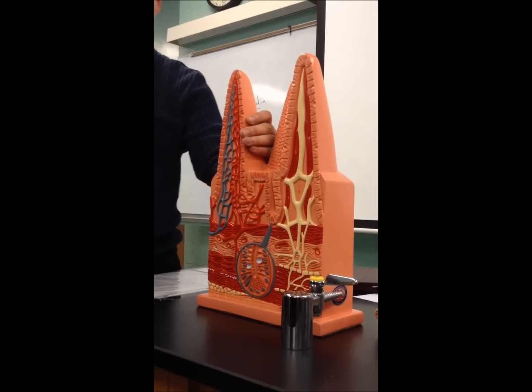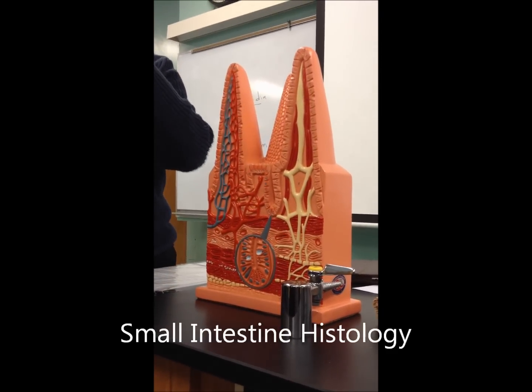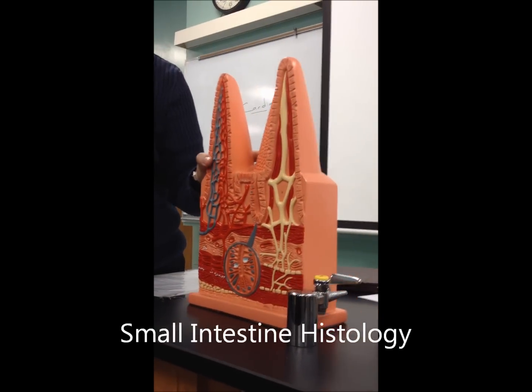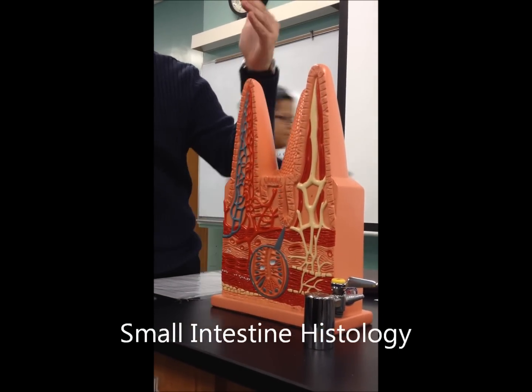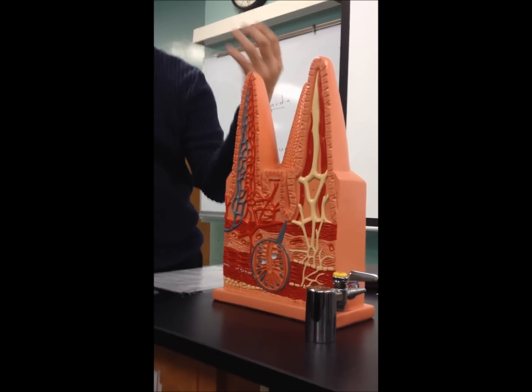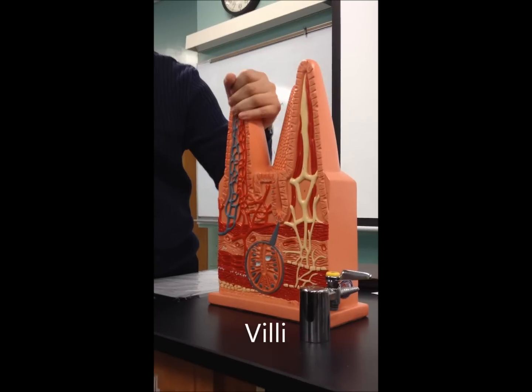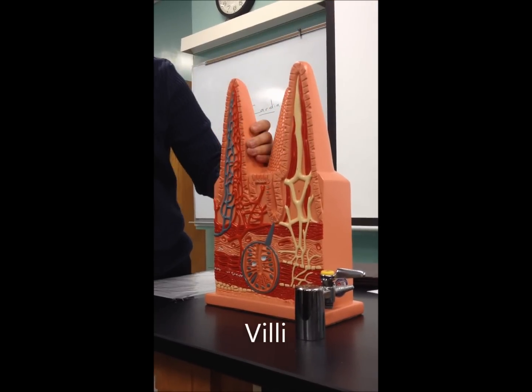The wall of the small intestine. As I said, when I was explaining, it's characterized by finger-like projections called villi. Each one is called a villus, and all of them will be called villi.